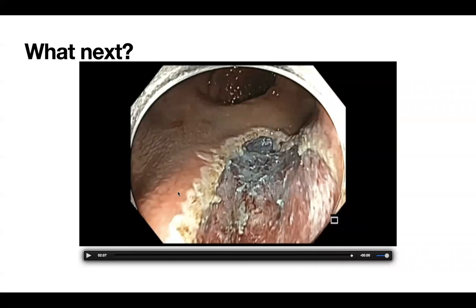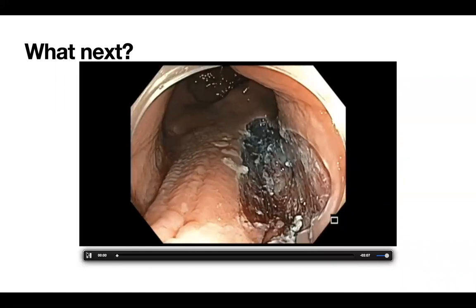You may comment and say, hey, you use two instruments. Why not? You could have done it with APC. I think that is a fair comment. Maybe down the road, when I see a case, I would probably use APC and do that. So I'm going to show you what I've done here.